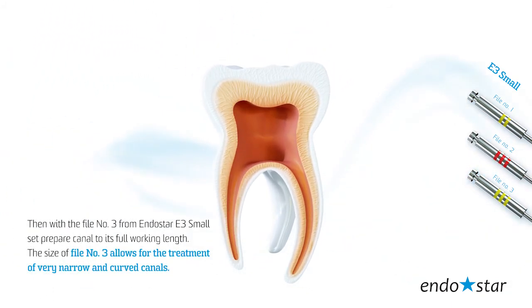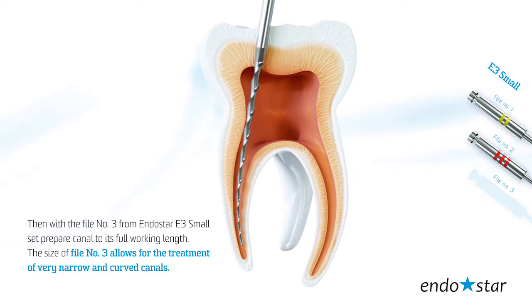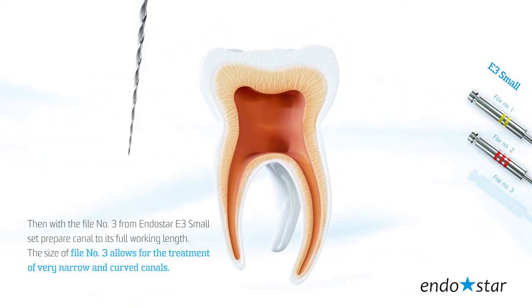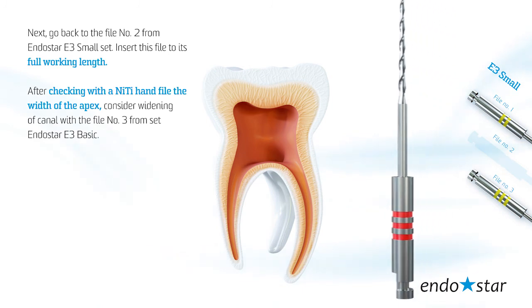Then with file number 3 from the Endostar E3 Small set, prepare the canal to its full working length. The size of file number 3 allows for the treatment of very narrow and curved canals. Next, go back to file number 2 from the Endostar E3 Small set.